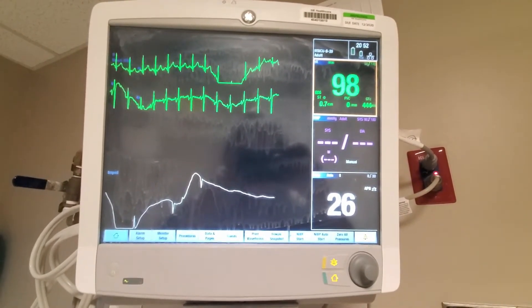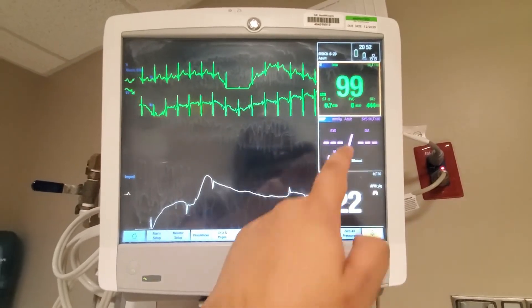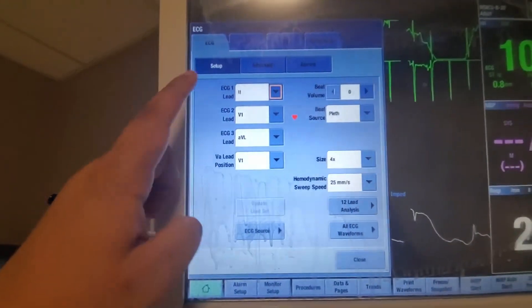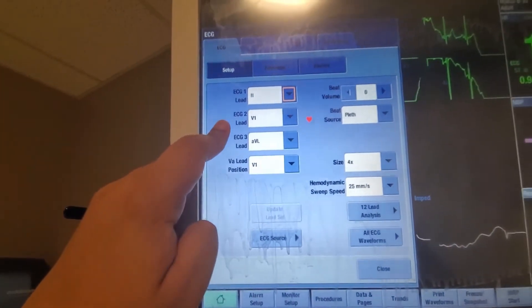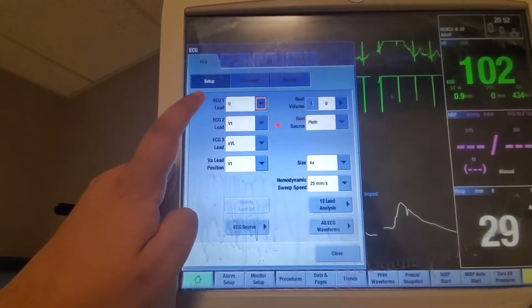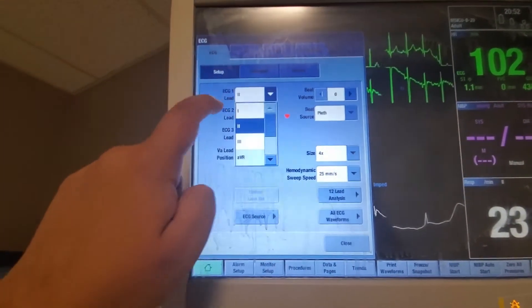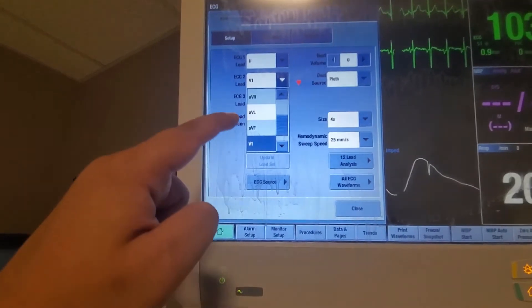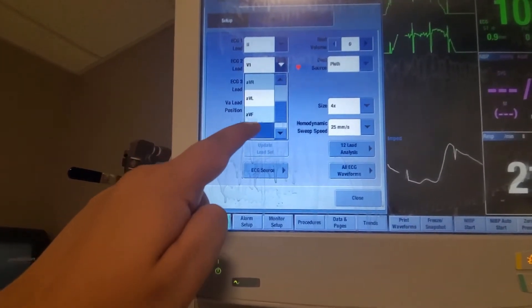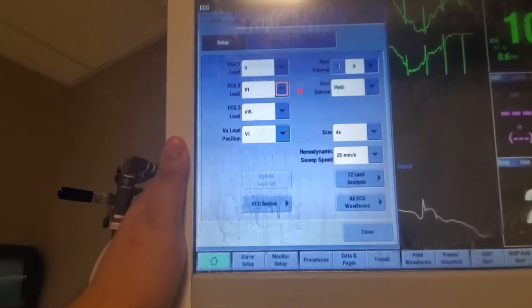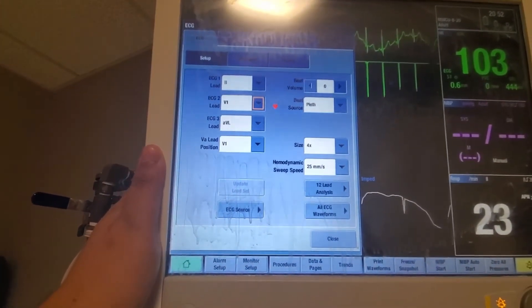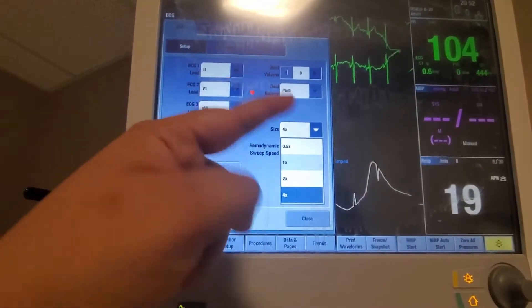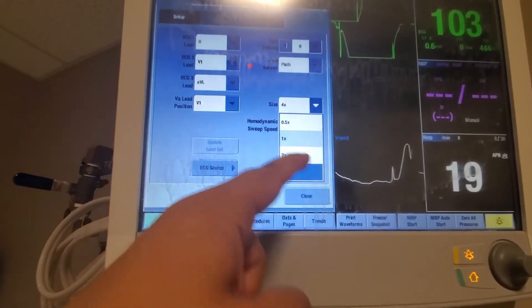Let's get into the first part. I'll show you how to change some things on your leads. You're going to go to your rhythm here, click there, and come over to ECG leads. You can choose which leads you want to see on your monitor by clicking the down arrow and choosing whichever one you'd like. Certain leads are better for certain things — the recommended leads are lead 2 and V1, but if you're getting a better snapshot from another lead, go ahead and go there.